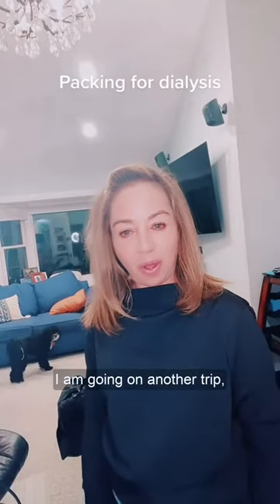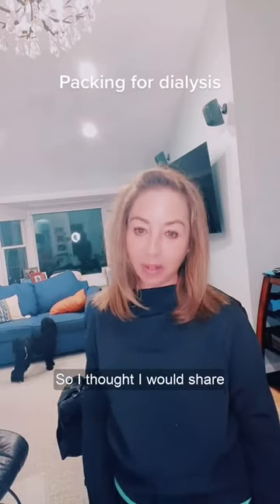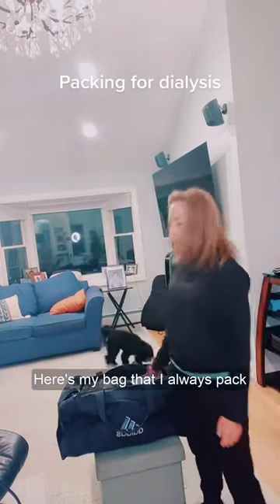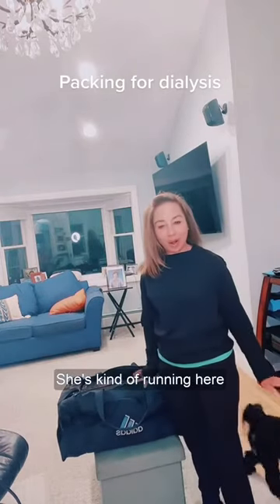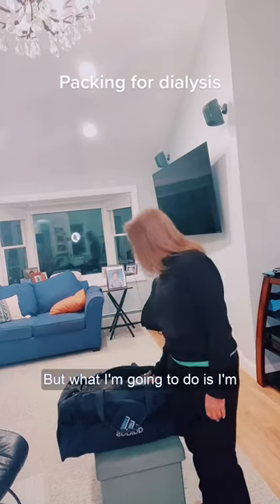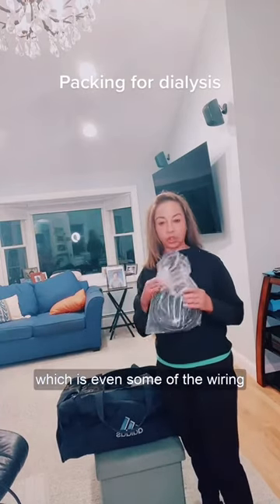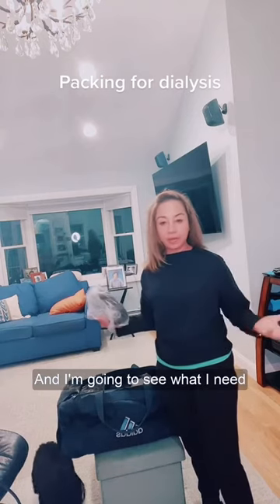Hi guys, I am going on another trip and I am about to get ready and pack, so I thought I would share exactly what I'm doing. Here's my bag that I always pack with — don't mind my dog running in the background — but what I'm going to do is unpack everything in my bag, including some of the wiring I need from the machine, and see what I need to repack.